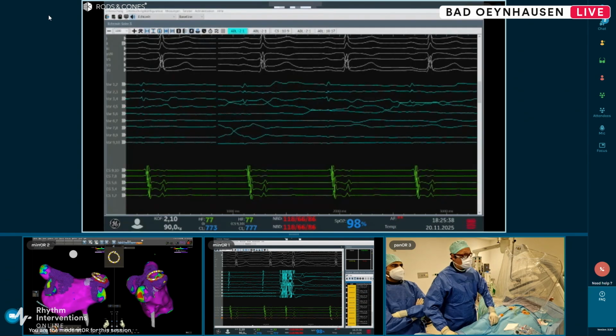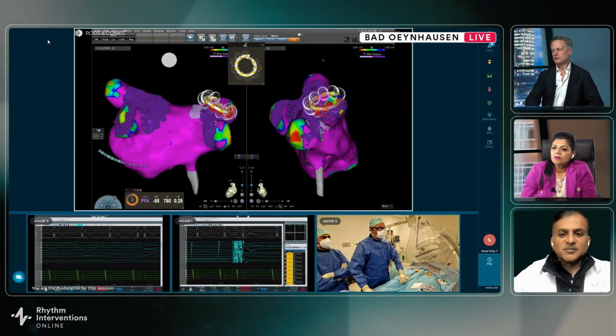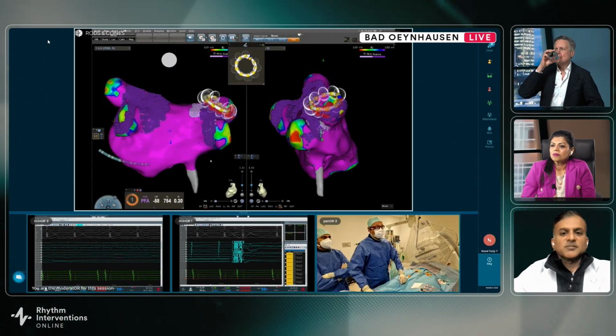The audience is asking, why does the catheter need irrigation? Is there a question? Please repeat.